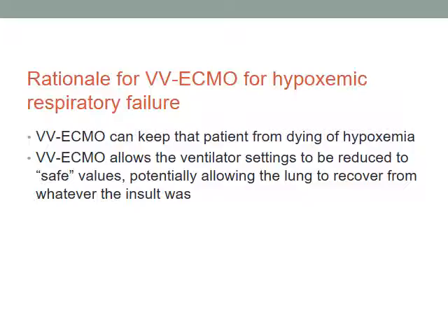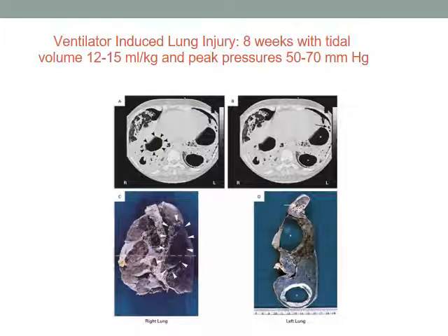So these are CT and autopsy pictures from a person who did not do well. They spent 8 weeks, not at our center, with high volume ventilation and high peak pressures. Now these peak pressures may sound ridiculous to you, and they are in the modern era, but I can tell you that when I started training in medicine, these were standard settings and standard pressures in bad ARDS.